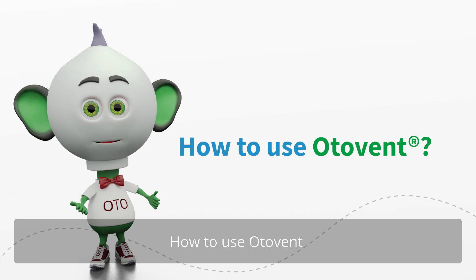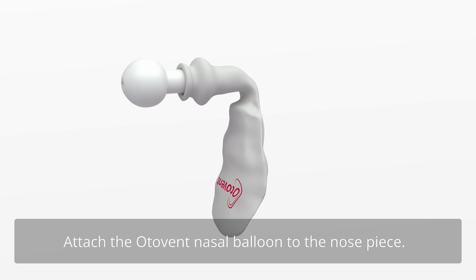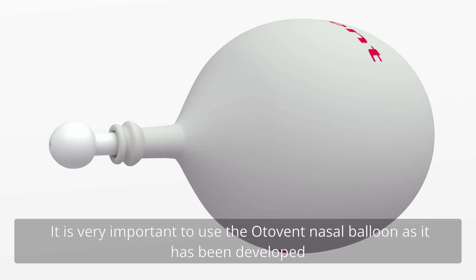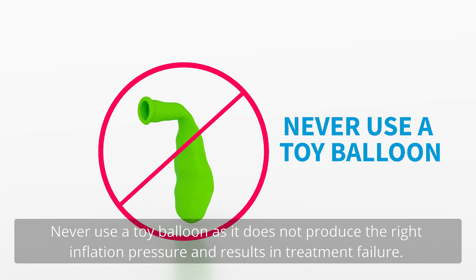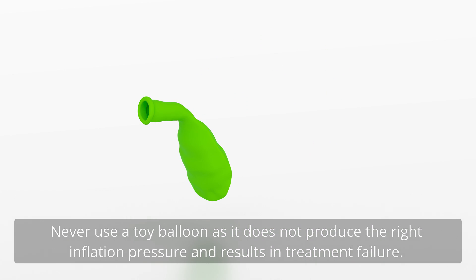How to use OtoVent. Attach the OtoVent nasal balloon to the nosepiece. It is very important to use the OtoVent nasal balloon as it has been developed for the purpose of equalising pressure in the middle ear. Never use a toy balloon as it does not produce the right inflation pressure and results in treatment failure.